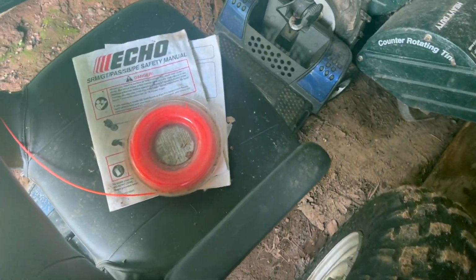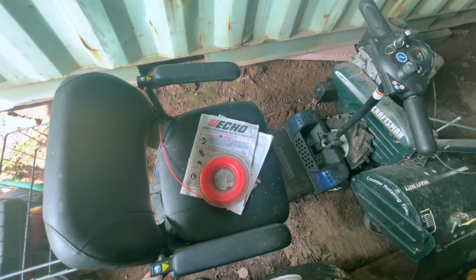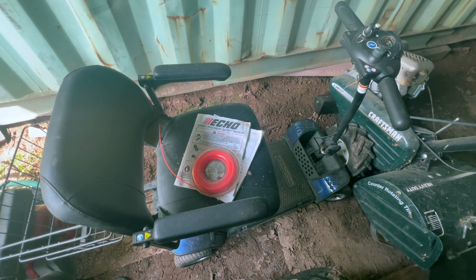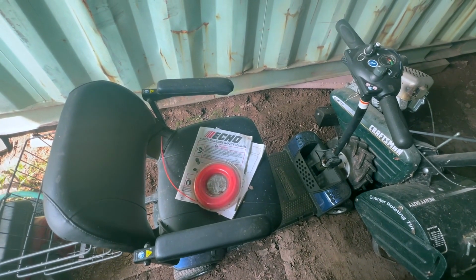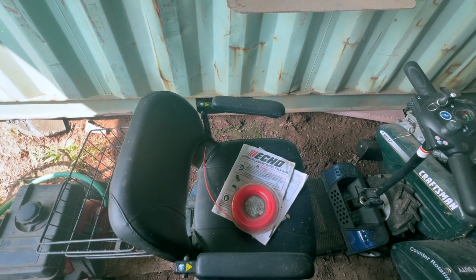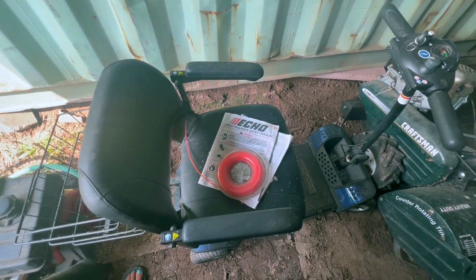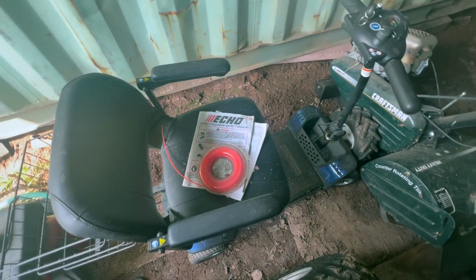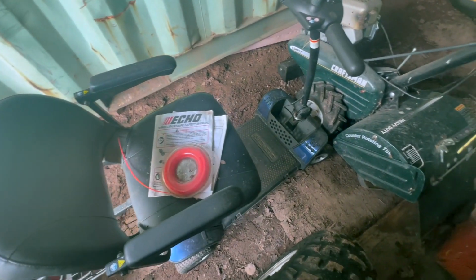About a month ago, I picked up this mobility scooter. Somebody was giving it away for free, and they also gave me something even cooler, but that project is going to be for another time. I have a little bit of time, so I thought maybe we'd start looking into this thing.